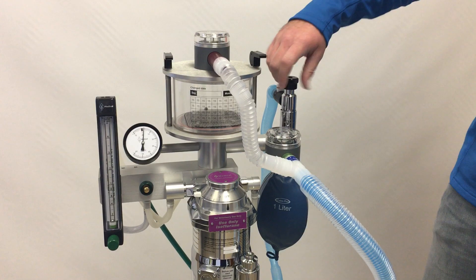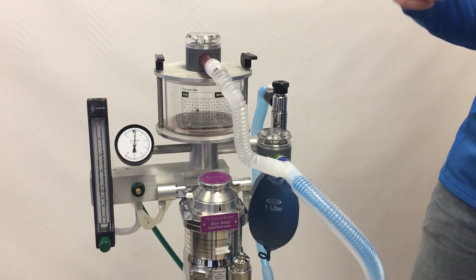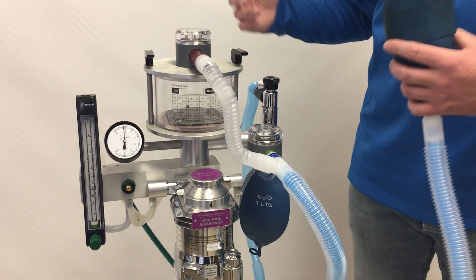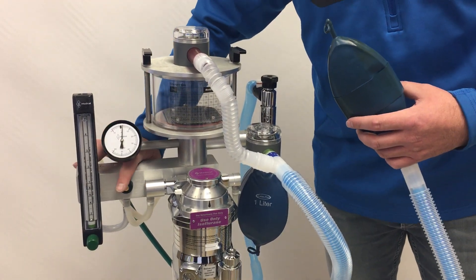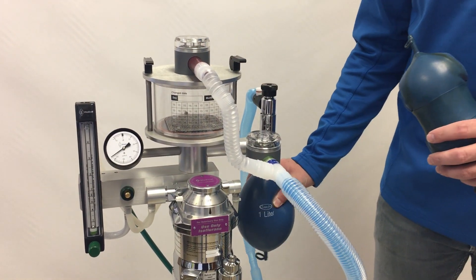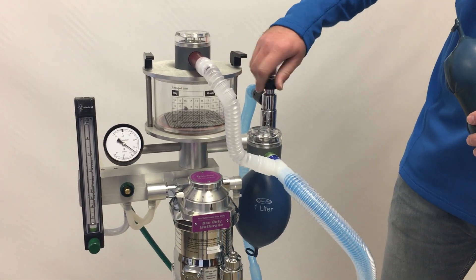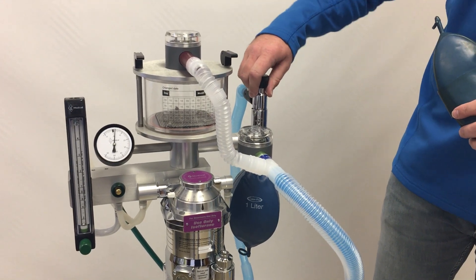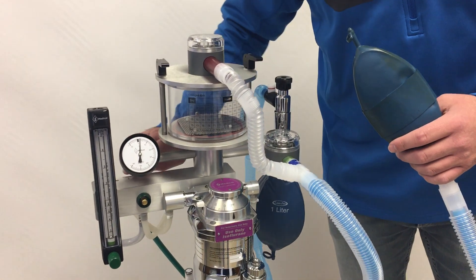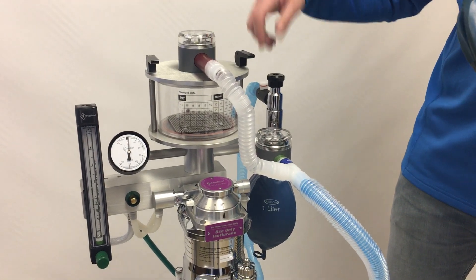If for some reason the pop-off valve is closed — whether forgotten during a pressure check, left closed by a service technician, or due to malfunction — we get a significant pressure buildup into the dangerous range. We can relieve it by opening the pop-off valve or disconnecting the circuit, but that disconnects the patient, and you may have no indication the pressure went that high unless you're watching the bag or the pressure manometer.